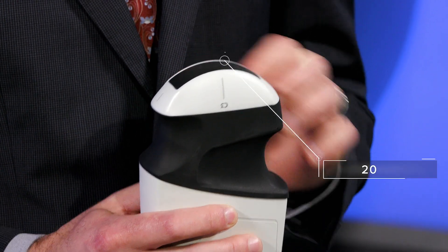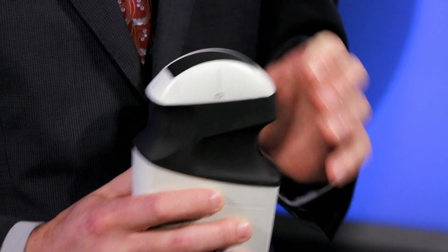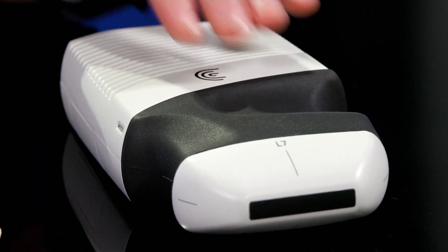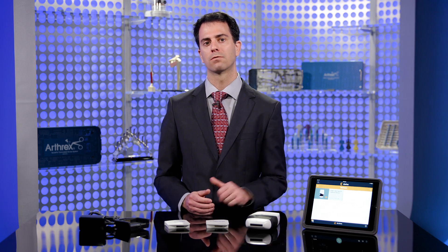Each scanner is built with 192 elements and four beam formers to allow for high-quality ultrasound imaging to be created. The scanners are fully sealed in a lightweight metallic shell for portability, durability, and protection from liquid intrusion.